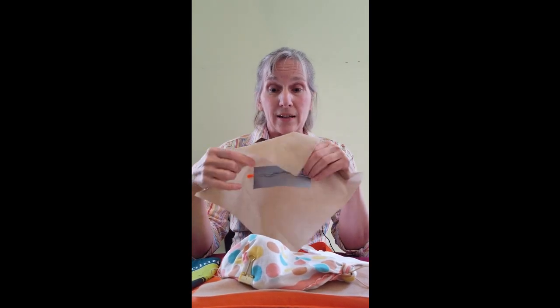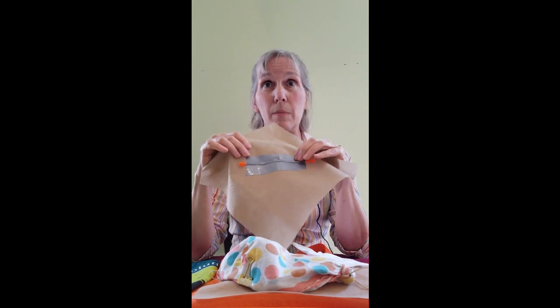So I'm going to give you the how-to steps of how to make a mask based on what you have, just using still photos. But the thing I really want to tell you while the video is running is the basic process is going to be to take your square, take a piece of metal. It is ideal if you have a needle and thread and any sewing ability to put this piece of metal in the fold, stitch along here, and that will stitch it in. But if you don't have a needle and thread and you just can't sew, use duct tape, use masking tape, use what you have. Make a nice triangle with that piece of metal centered in the middle.